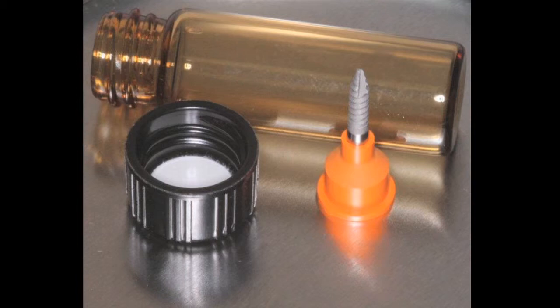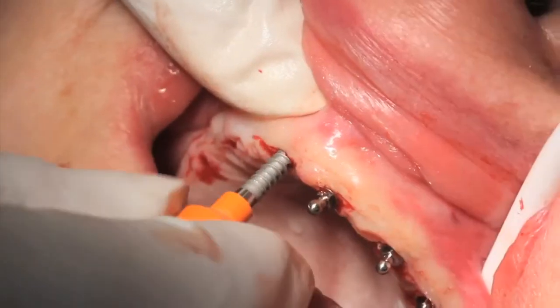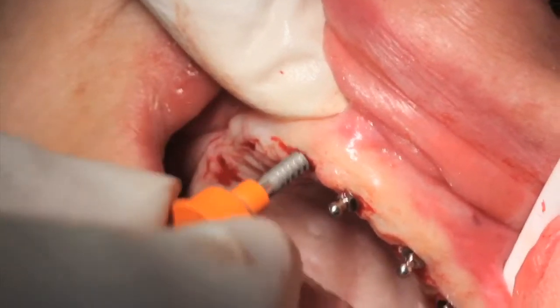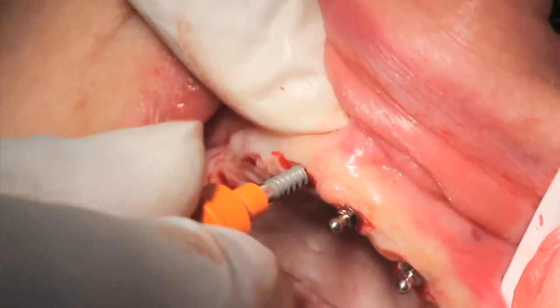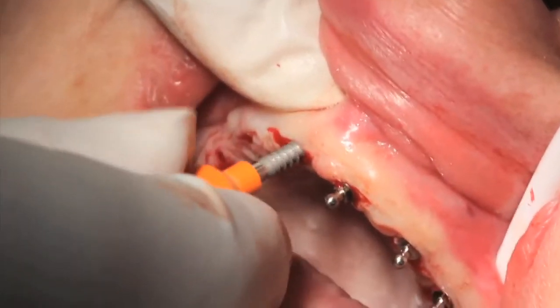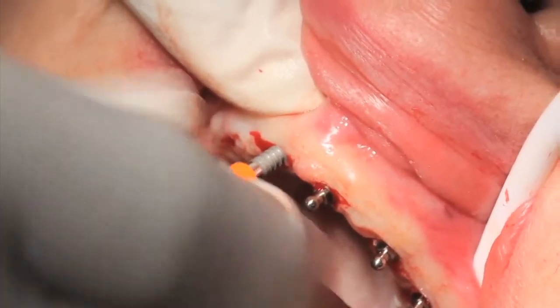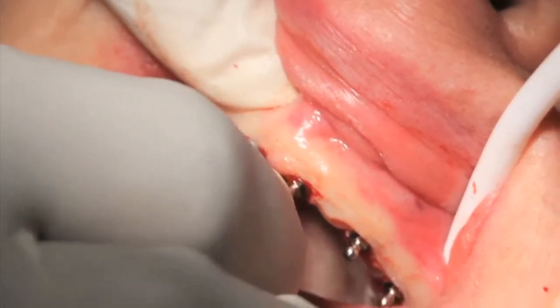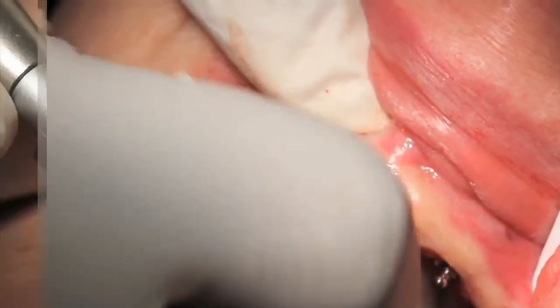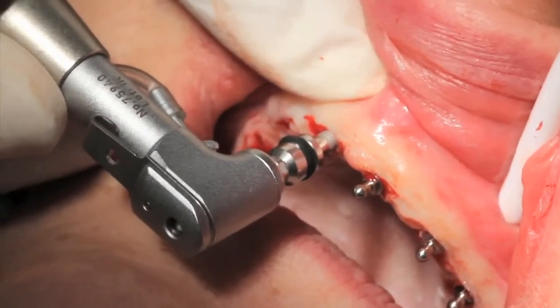The inclusive implants were removed from their sterile packs and glass containers and hand-tightened until they are difficult to turn. The inclusive mini implants are self-tapping and there are no other final drills or bone formers necessary. The implant will follow the path created by the twist drill and compress and condense the bone to help achieve immediate stability. In certain cases, it is possible to engage both cortical plates for even more stability. The handpiece attachment was then used to gently rotate the mini implant to depth.